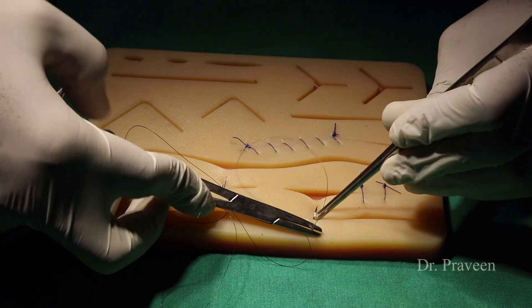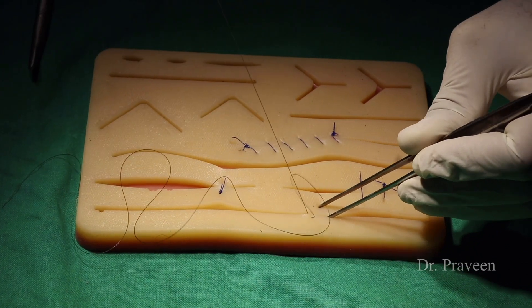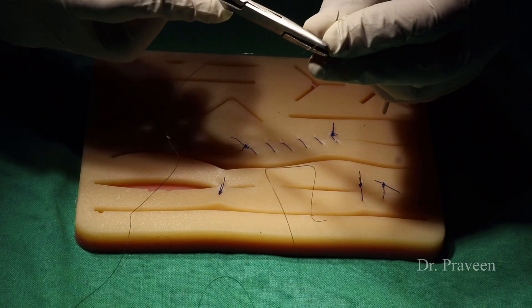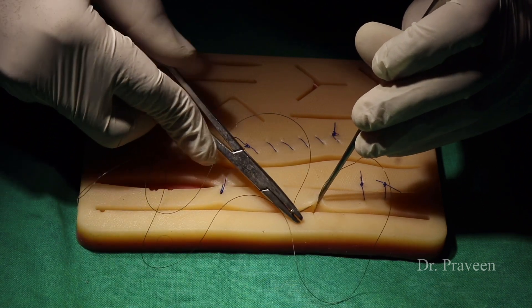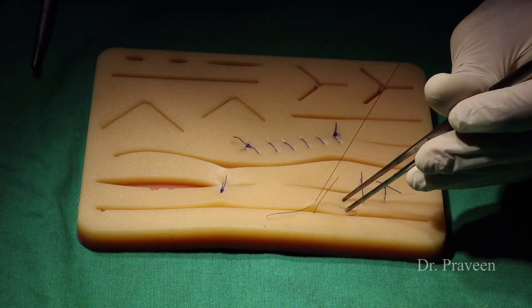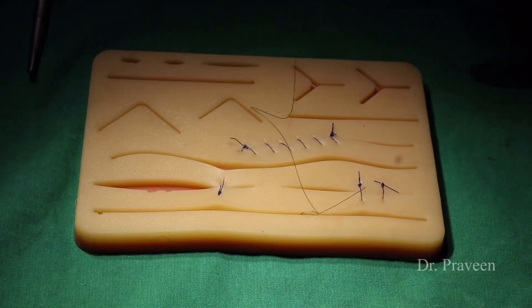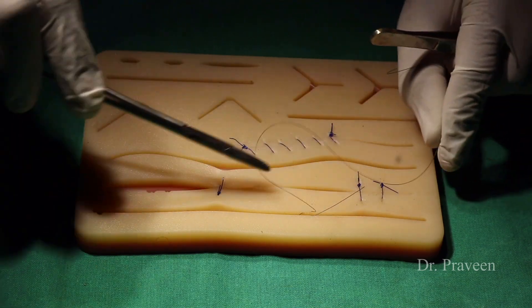The disadvantage is that it is not possible to open a part of the wound when seroma, hematoma, or infection occurs. Initially you take a bite within the skin margins, then secure with knotting. The needle is not coming out of the skin — it is passed in the dermal layer of the skin, not visible outside.